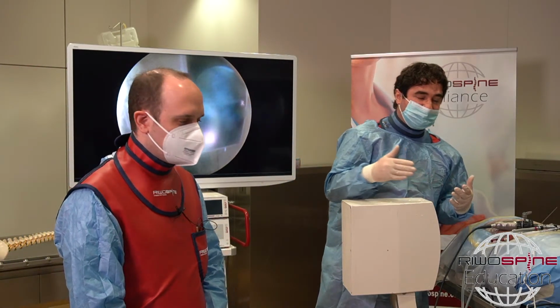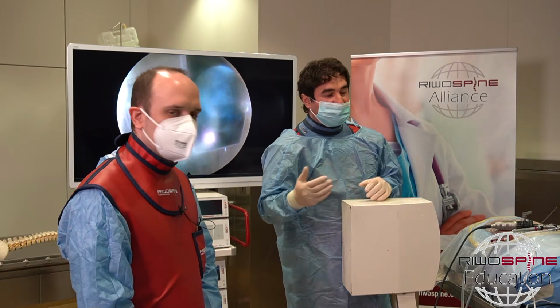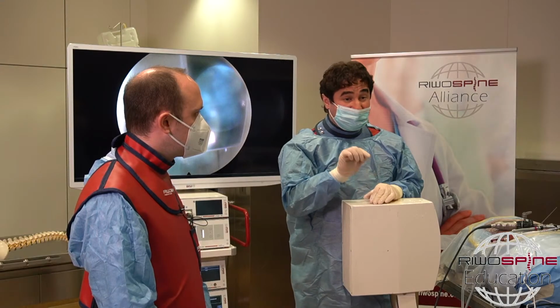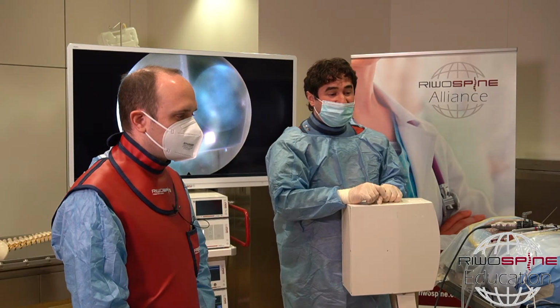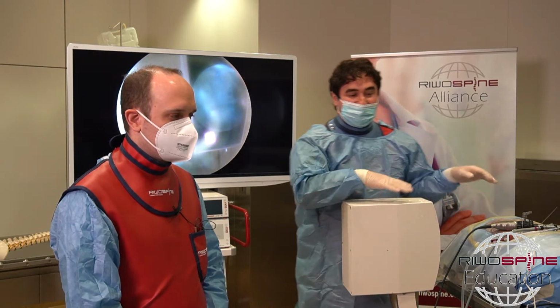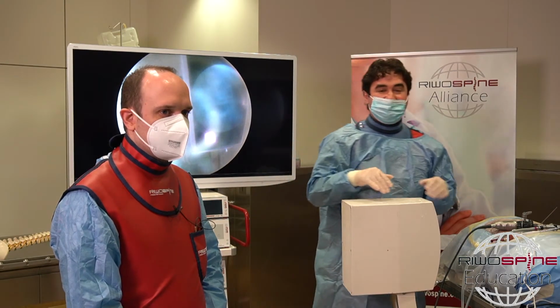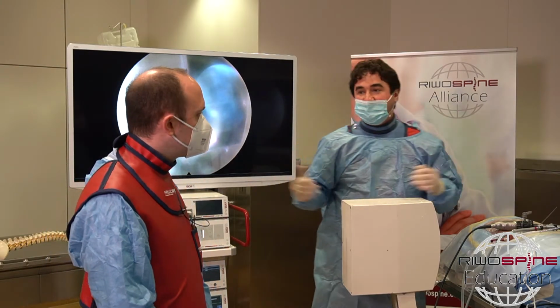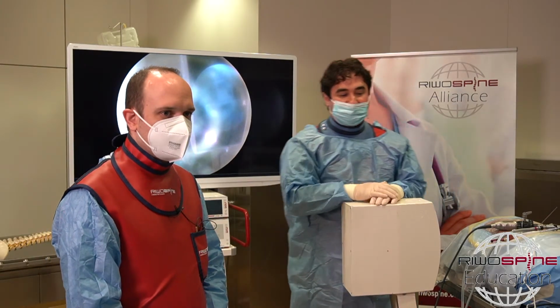Then you can do a contralateral interlaminar approach to reach the contralateral intraforaminal area. But in this case, I would prefer to extend the bony resection a little bit to the facet joint on my side. Then I would prefer again the ipsilateral operation.